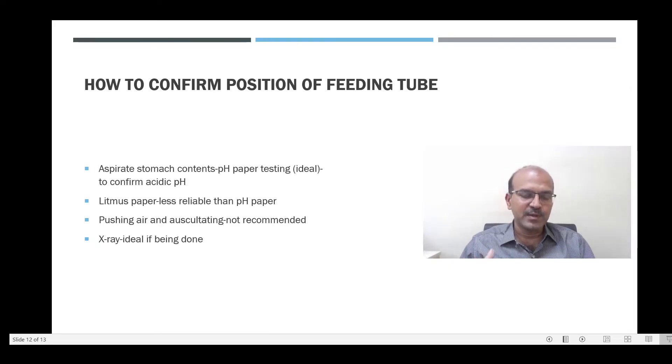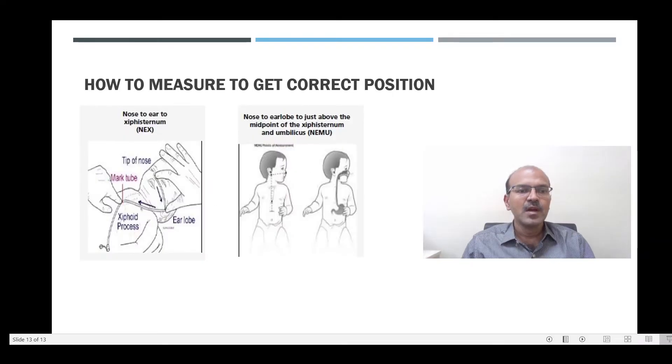Babies do not grow that quickly, so for a week or so the same position is fine. We have two main measurements: nose to ear to the xiphisternum — that is, from the nose to the earlobe and then to the xiphisternum. These measurements are usually a little short and you may need to add 1 or 2 cm.